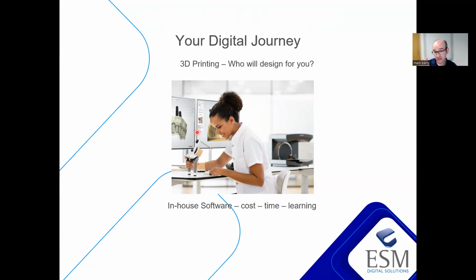What we're starting to see now is some dentists will do a scan and send it to the lab. The lab does the design, and then the clinician will print in-house. That's one solution. So yes, you could buy software. When people come to us and ask, can we buy all the design software, for example, because I want to design a bit of everything, we generally say no.